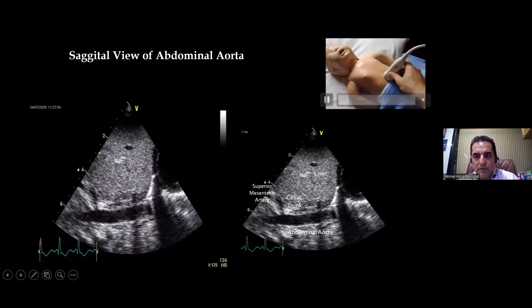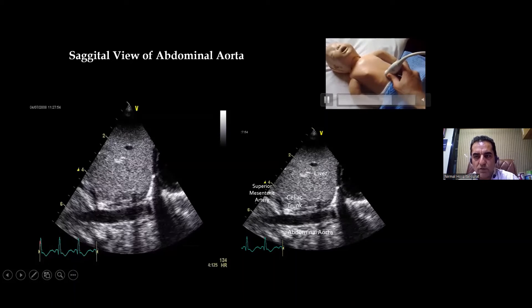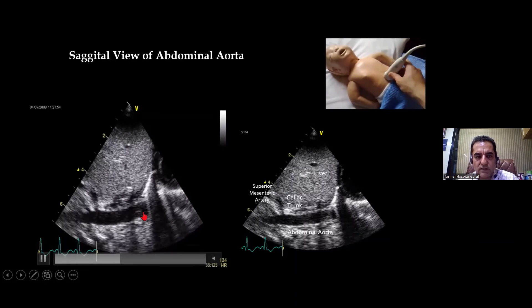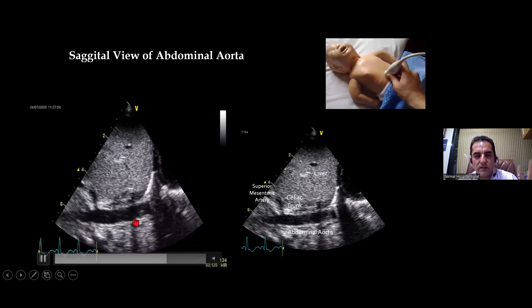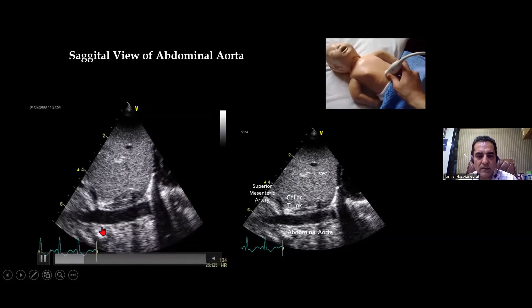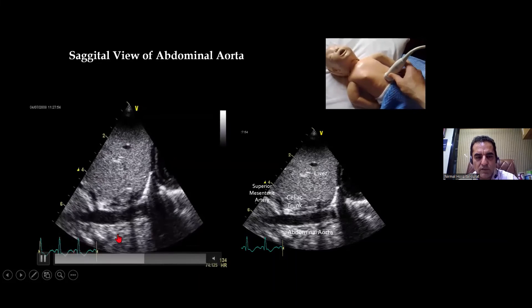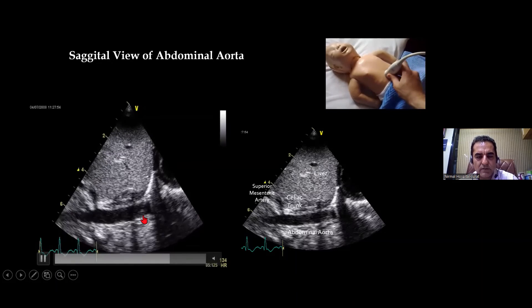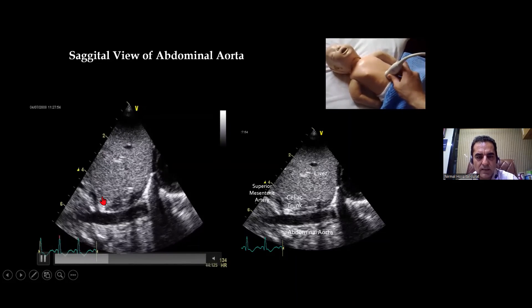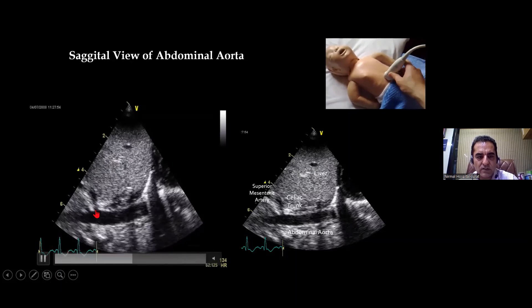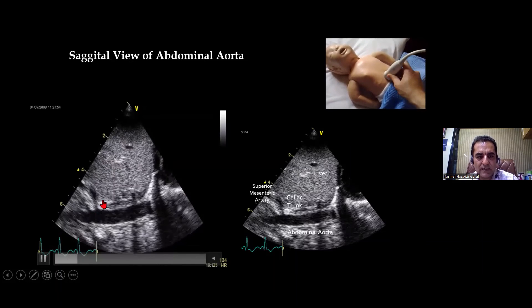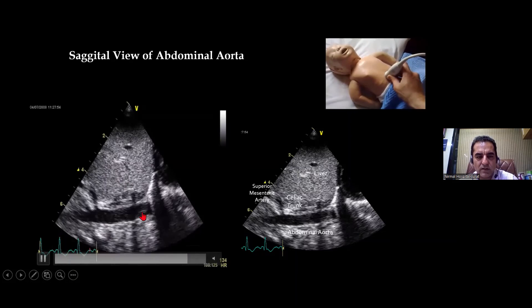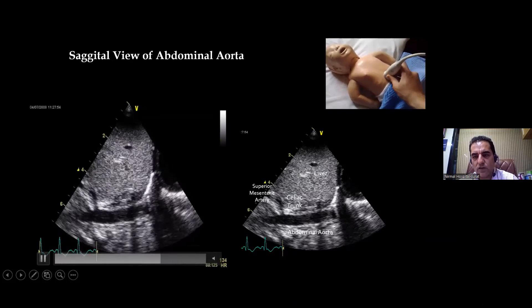Keeping the pointer up there, if I sweep towards the left side, I would see this engorged pulsating vessel. Just below, we will see the spine, and this engorged pulsating vessel has two branches — celiac and SMA going out of this trunk. So this is your abdominal aorta.